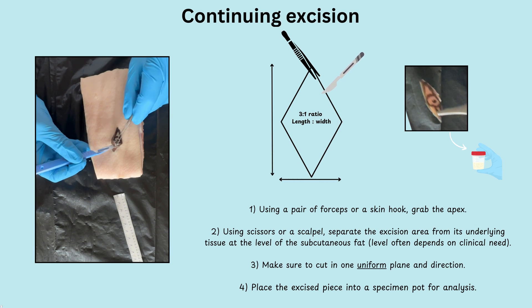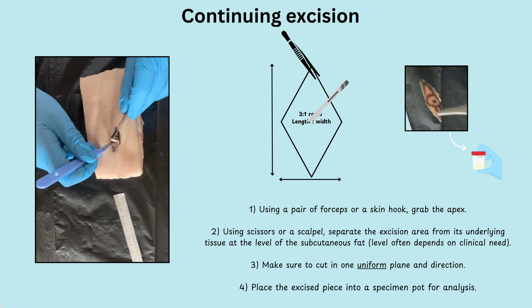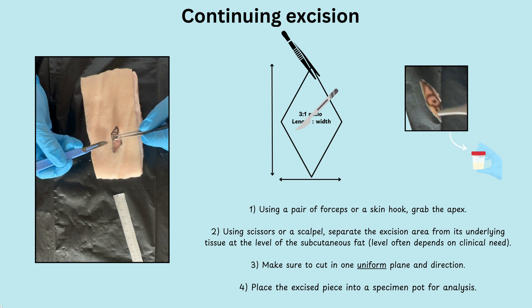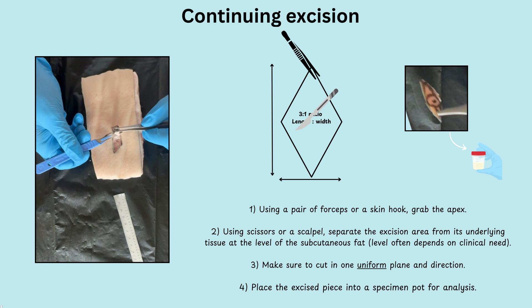Using a pair of forceps or a skin hook, grab one of the apexes at the top or bottom. Using scissors or a scalpel, start separating the excision area from the underlying tissue at the level of the subcutaneous fat. Make sure you are cutting in one uniform plane — one direction. Once you have the excised piece, put it into a specimen container for analysis, or in this case set it to the side.